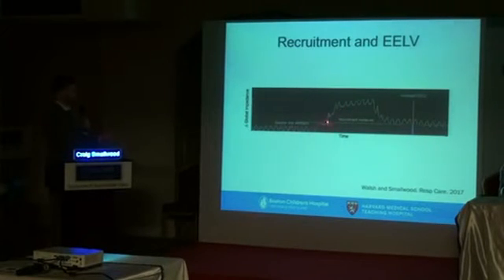So we're doing tidal recruitment here basically, and the end expiratory lung volume is going to be very high. We're probably going to have lots of overdistension during that period, lots of orange if we were to look at an image similar to that first. But then what we do is the titration phase. We come down, we reduce the end expiratory pressure, but what we want to see is to make sure that when we reduce, coming on the tail end of this after we've performed the recruitment maneuver, we've hopefully resolved that atelectasis, and that our baseline end expiratory lung volume by global impedance isn't any worse.